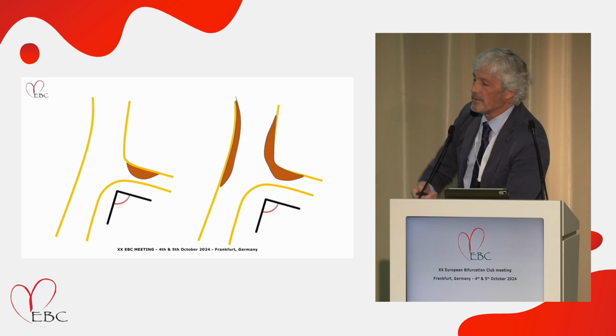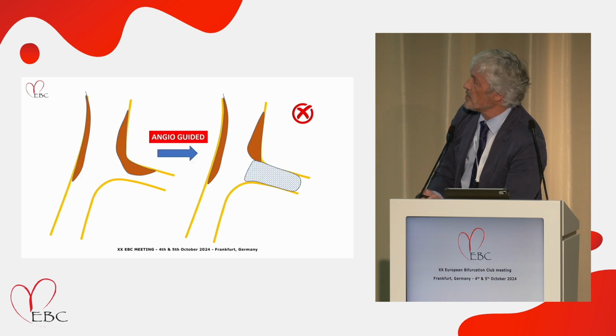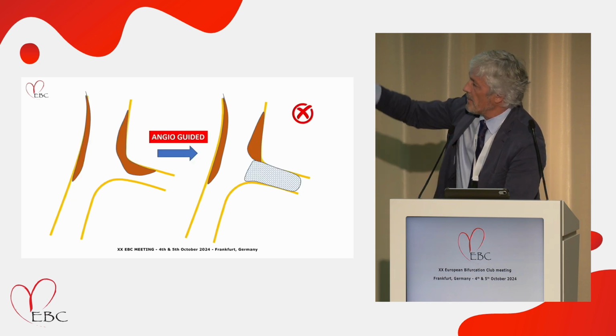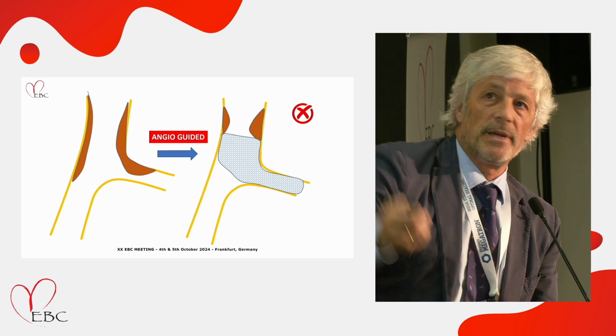For those cases that are perpendicular, things appear simple, but it's not so simple. Angio-guided, maybe we have this, and we have more plaque that is shifted to the main vessel, or we can have the same problem.